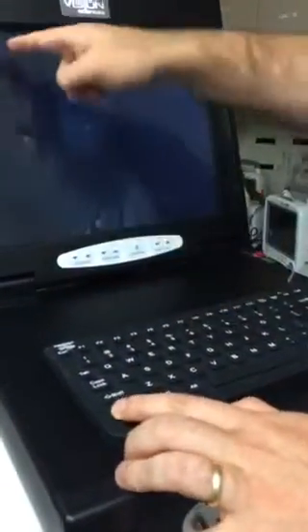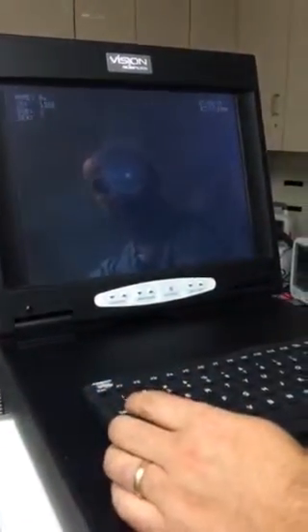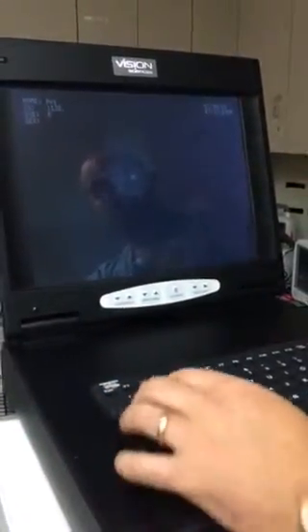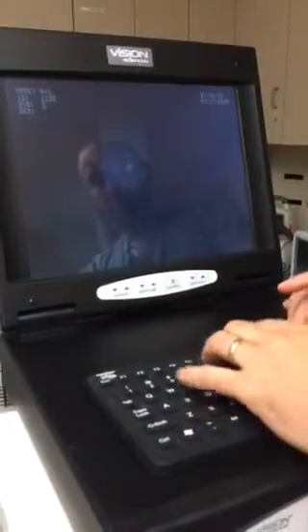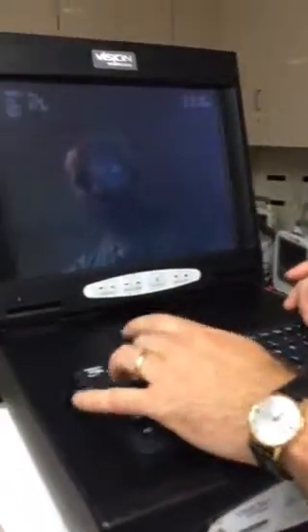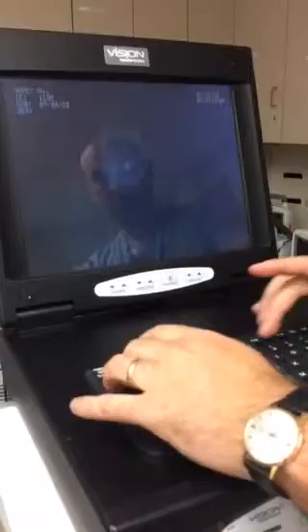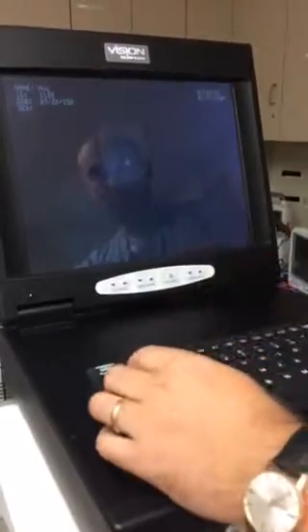So you hit Control F3, the cursor comes up. Let's do ID, then use the arrow keys down, and put in an ID number if they have an MR number. Then you put the date of birth.